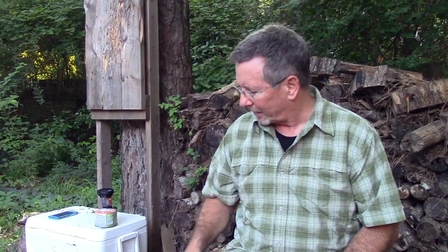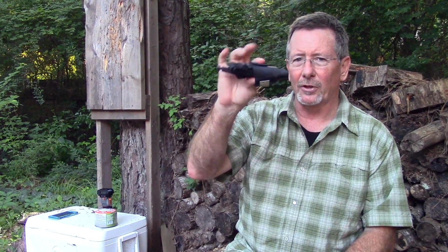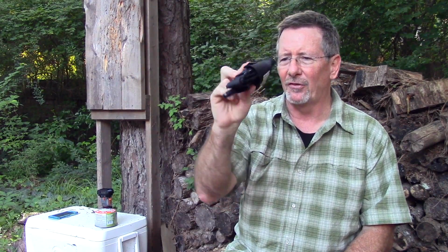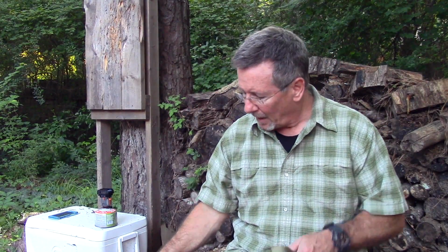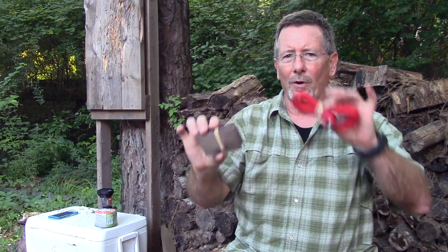So anyway, there are 3 basic types of tourniquets from what I can tell. There is the classic windlass style tourniquet, and this is the SOFTT-W. It's also a CAT tourniquet, which is very, very similar. They're almost the same, there may be a couple of little differences. I have the SOFTT-W, not the CAT. Then there are elastic tourniquets like the TK4 and the RATs.